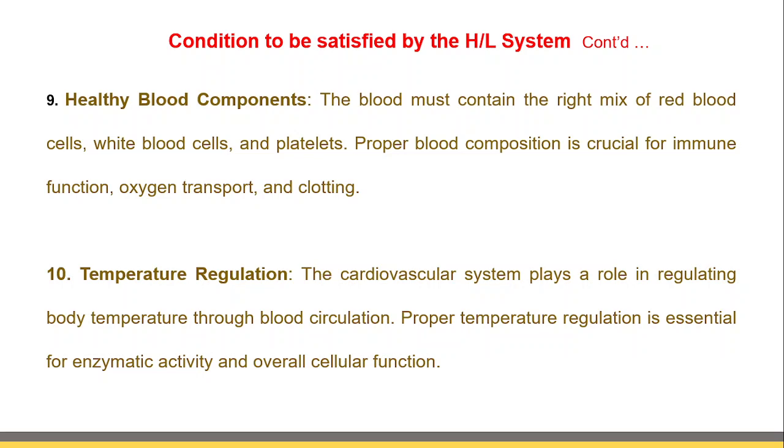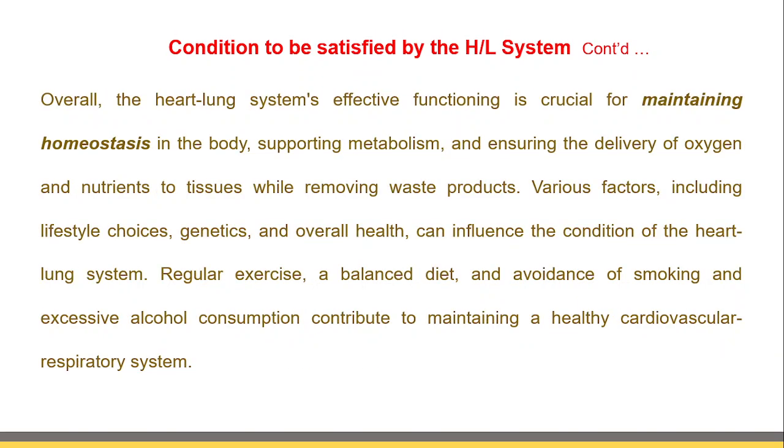These are the 10 different functions or conditions to be satisfied by the heart-lung system. If the conditions are satisfied, then the heart-lung machine can work properly and you can carry out the cardiac surgery. Overall, the heart-lung system's effective functioning is crucial for maintaining homeostasis in the body, supporting metabolism and ensuring the delivery of oxygen and nutrients to tissues while removing waste products.